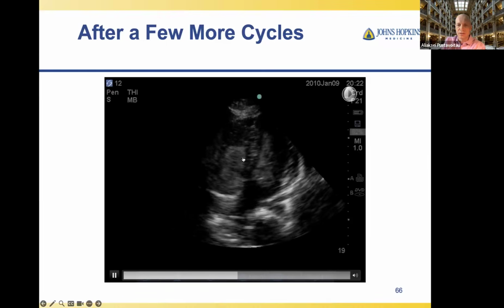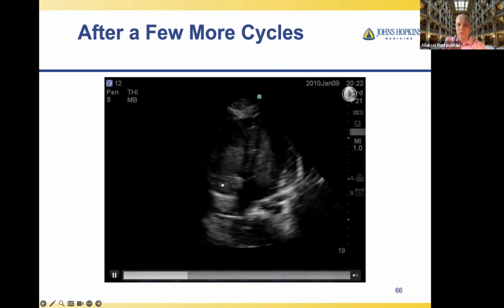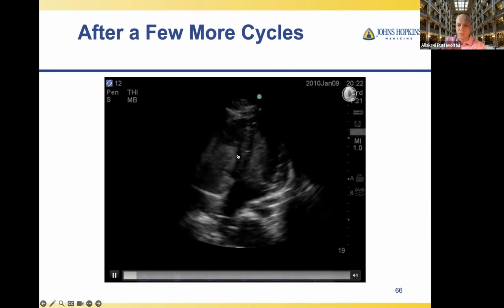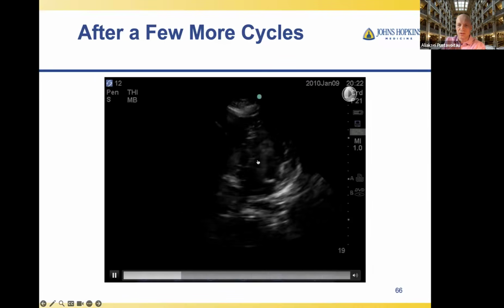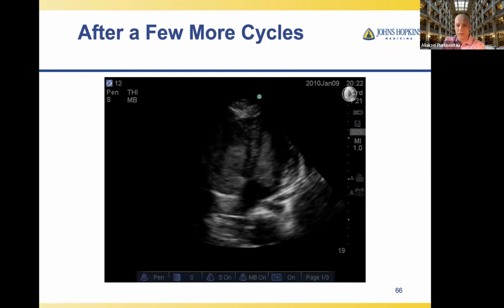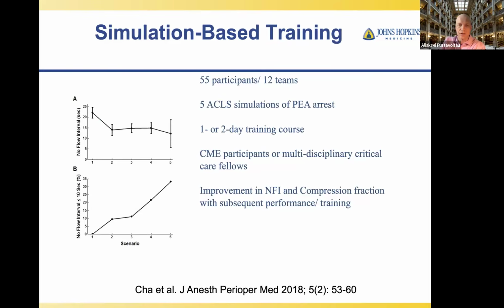So all you see here is blood almost starting to form a clot. It's just shimmering, more so with someone continuing respirations, right? So there is a little bit of movement of blood, but there is no contraction of chambers. These are right-sided chambers here, right ventricle, just filled up with blood. Left ventricle, there is no motion, just shimmering of blood. Left atrium is here. So unfortunately, it progressed to cardiac standstill. We had to declare that this patient died, but that's part of the scenario, to recognize what can actually happen.